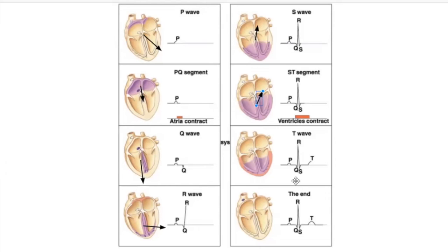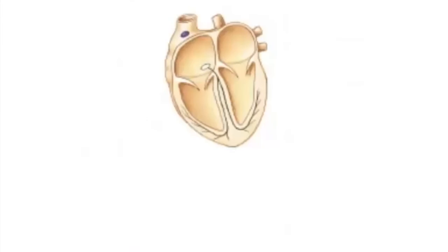And then I'm not going to talk about the T-wave at all because it's very complicated and it's not well understood. So then we want to figure out a way to actually measure this and have some intuition for what we're measuring and what it means with respect to the heart, right? So if we're saying we're going to represent the activity of the heart with this dipole, then when we measure characteristics of this dipole, we can then intuit certain things, like this is the direction activation is going broadly in the heart. Okay, does it make sense how that would be useful?